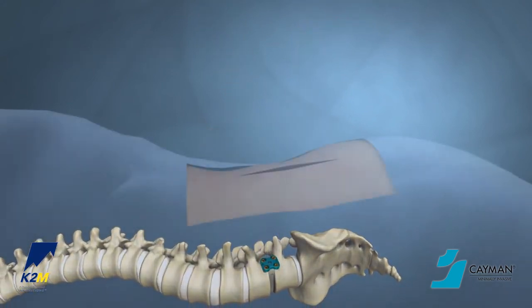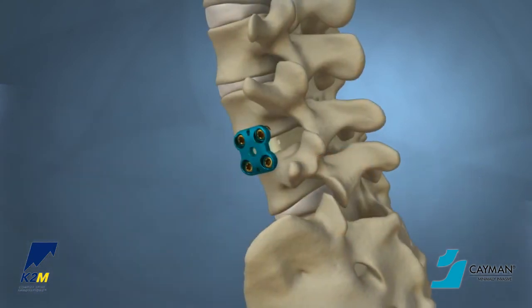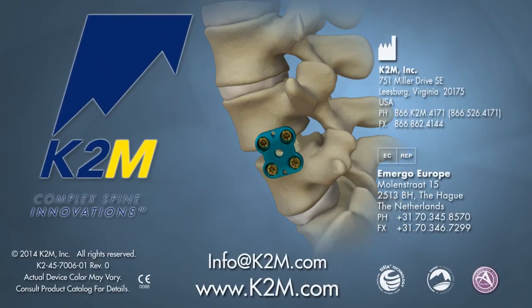When the construct is complete, perform a standard multi-layer wound closure. The Cayman Minimally Invasive Plate System from K2M, Complex Spine Innovations.